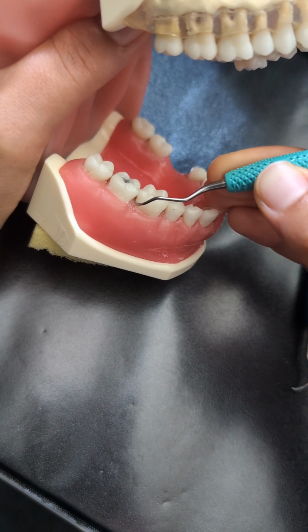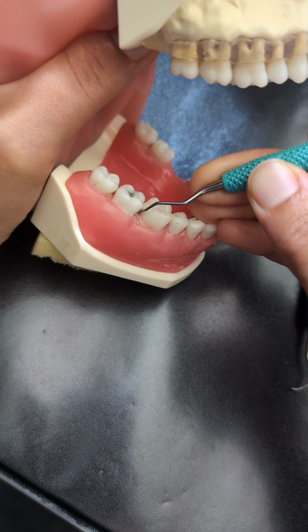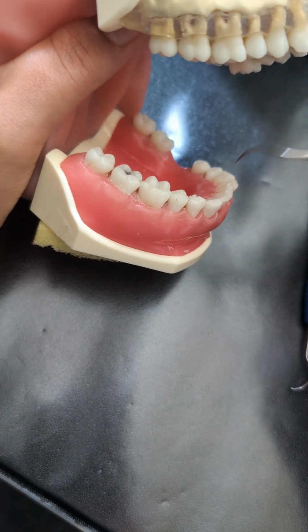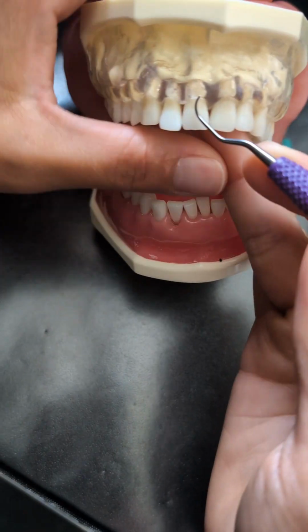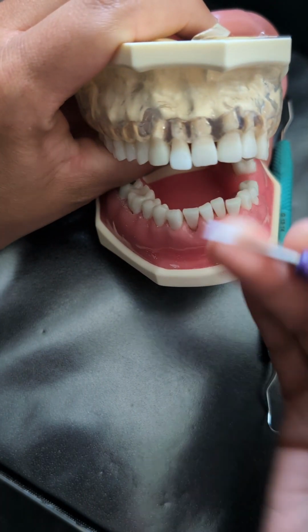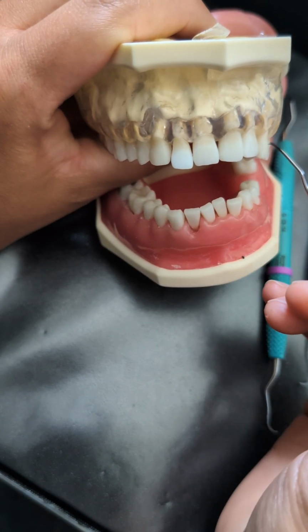So we close, we insert, we open, and we activate the instrument toward the tooth. We start from the most posterior tooth forward. Same with 11-12. From the most posterior tooth, mesial surfaces forward. And for anterior teeth, from midline, we work away surfaces and toward surfaces, canine to canine.